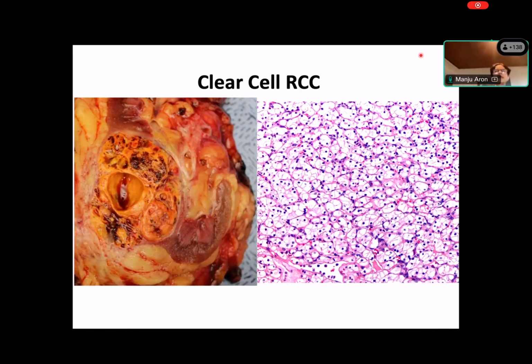Now, in the next few minutes, I'll try to quickly run through the common tumors that you see in the kidney. Clear cell RCC: golden yellow, can be variegated, with a characteristic morphological appearance with clear cells.